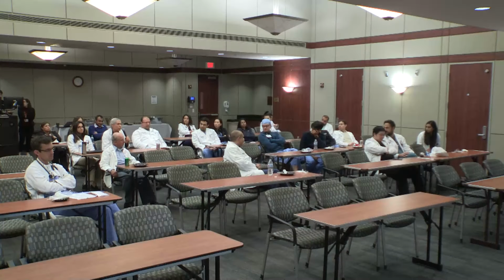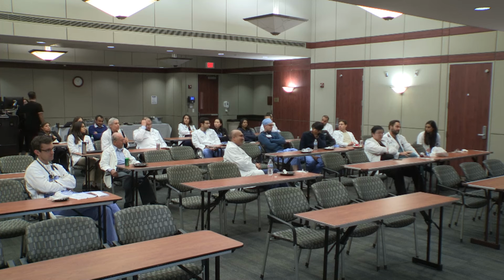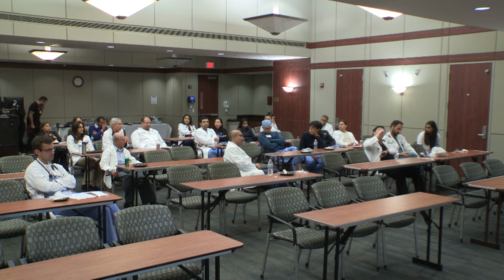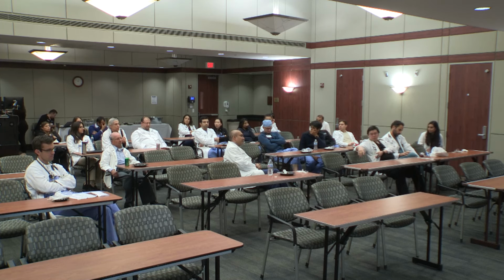One thing I want to mention is that you have to remember the strength of CT is to exclude disease, not identify disease. That's why it's not indicated in people with known disease, because in many respects you really can't accurately read those kinds of studies. And FFR doesn't work very well in people with known disease who have a lot of calcium, because that can also lead to errors in the FFR calculation. So it's really a test to exclude disease or find mild plaque that you wouldn't ordinarily be able to find. It's not a test to find advanced disease.